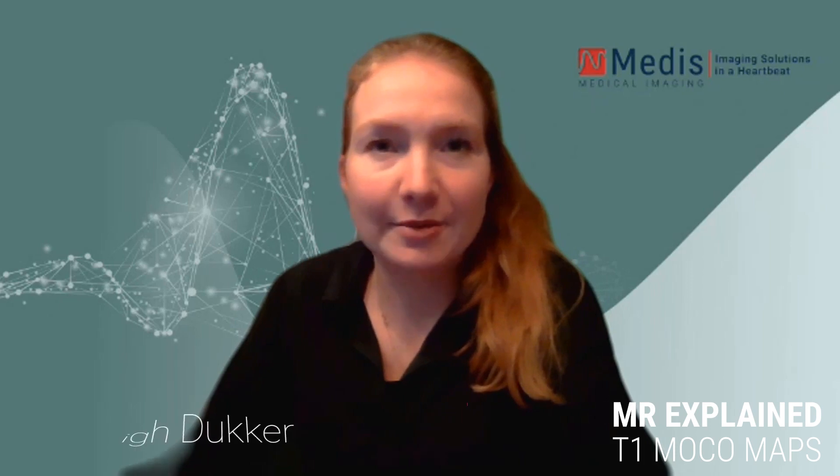Hi y'all, welcome to another MR Explained. I am Kayleigh Dukker, I'm the product manager of MR at Medis. Today I will be telling you about our new AutoQ module. This will provide you T1 maps with motion correction. So let's go to the program so I can show you what it entails.